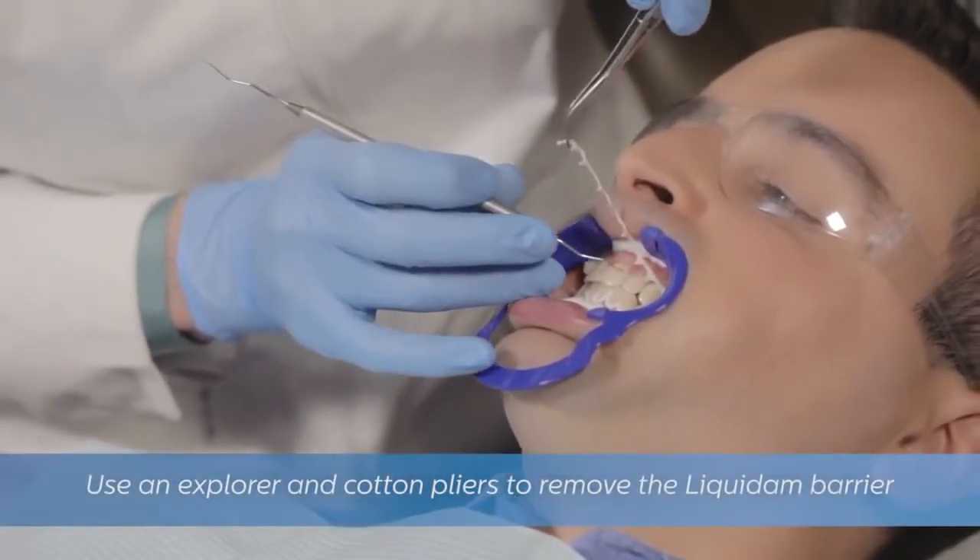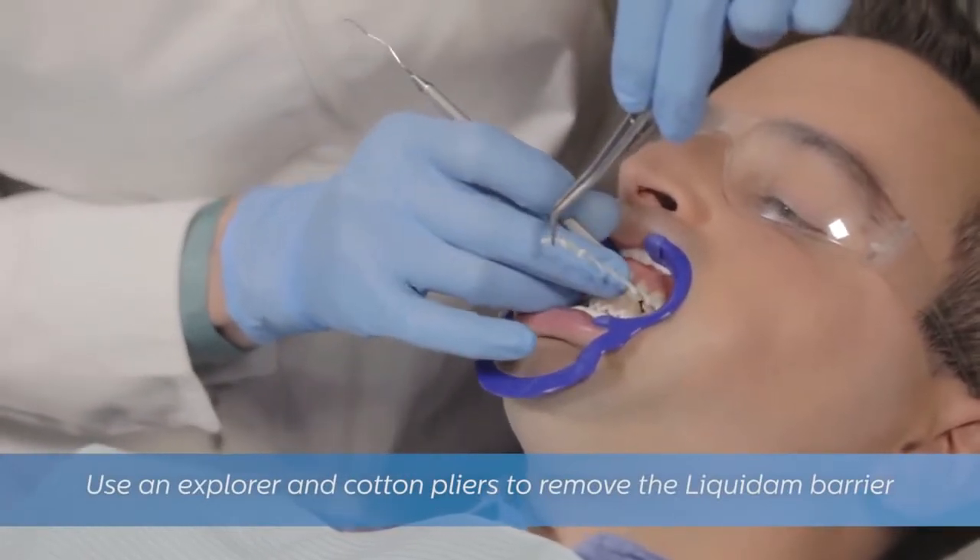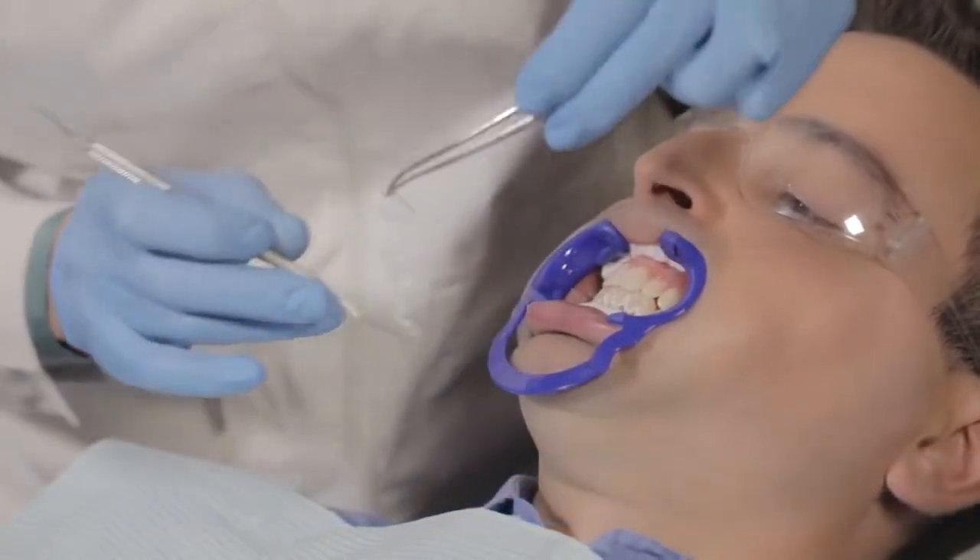For best results, use an explorer and cotton pliers to remove the Liquidam. If adding a fluoride varnish, it can be applied to non-treated tooth surfaces after removing the Liquidam barrier.